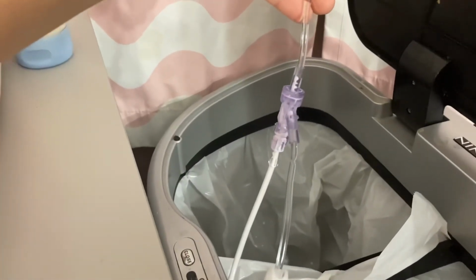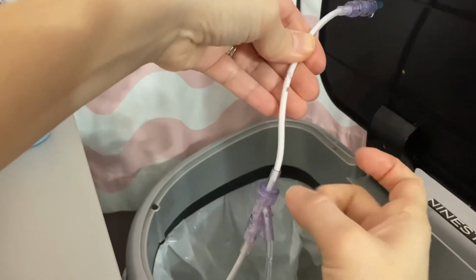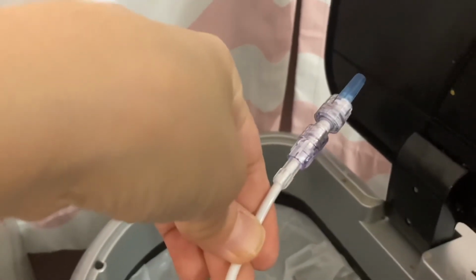Sometimes there can be an air bubble where the lipids and TPN connect. The last thing you need to do is prime the lipid pump just a little to make sure there's no bubble. If there is, you just let the pump run until the bubble is out.